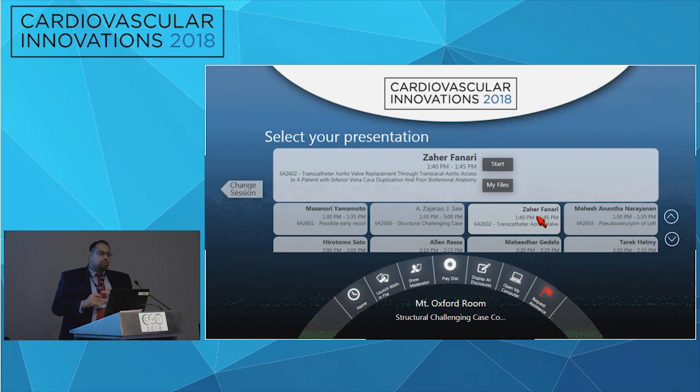We have some patients who had some oozing before. If she was not obese, we would be okay because holding pressure and things like this will work. Here we were really worried because another patient lost like 3–4 grams, the patient did fine finally, but they were so obese that the figure of 8 was not completely fine.